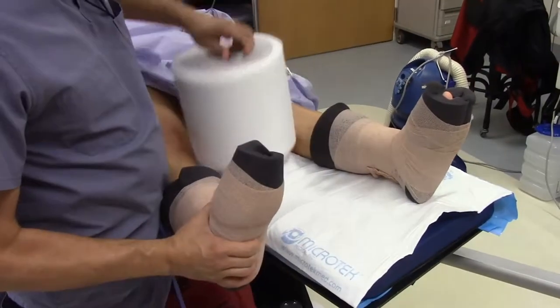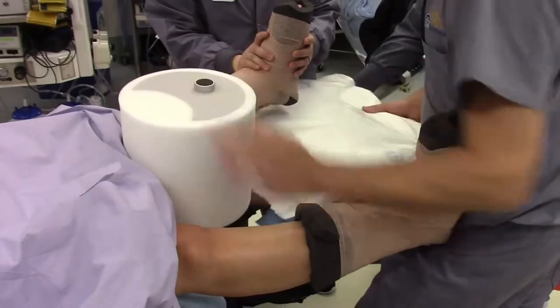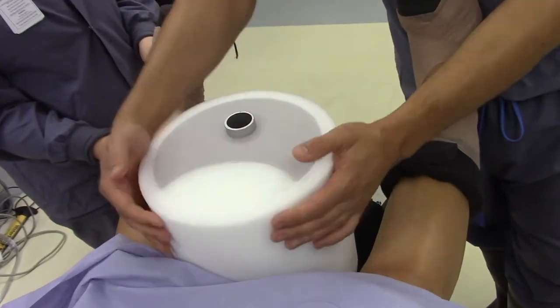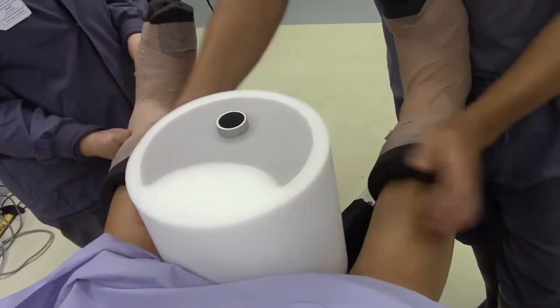The perineal post is applied between the legs. This is an oversized perineal post with a double foam assembly which disperses the force across the perineum. The internal gray foam is harder than the external white foam, so the pudendal nerve is protected during surgery.